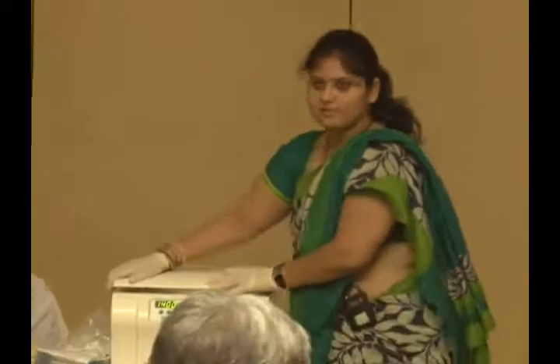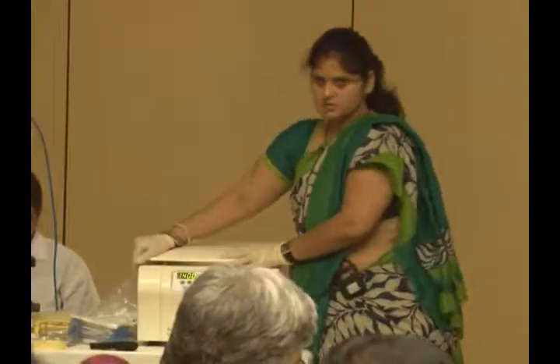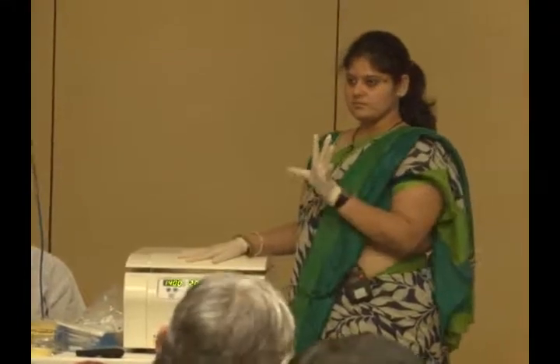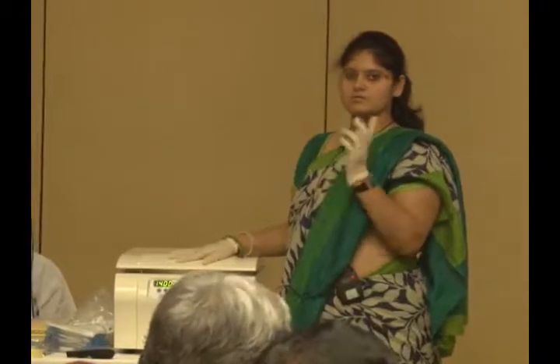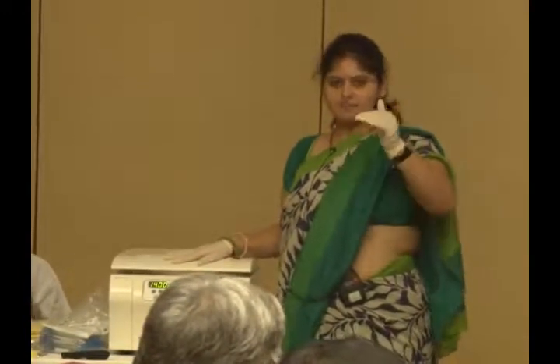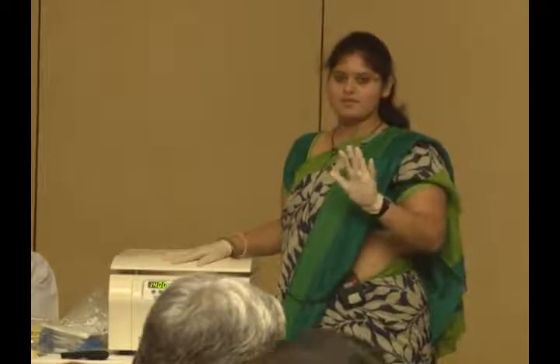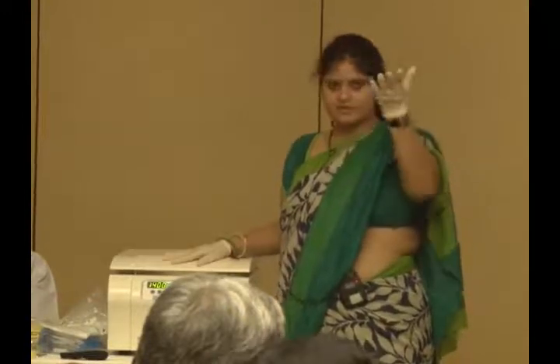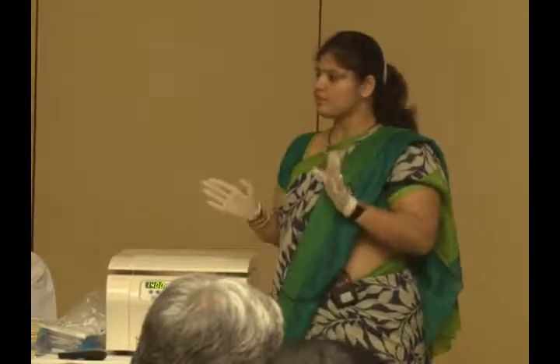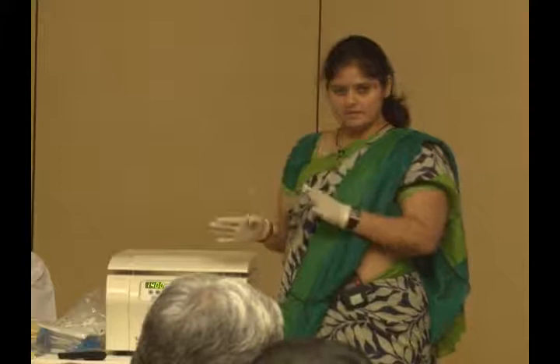The ideal time for the first centrifugation is 20 minutes, or you can put it at 1800 RPM for 15 minutes. If you reduce the time and increase the RPM up to 1800, there is no damage. But you cannot go beyond 1800 and you cannot go beyond 20 minutes. So remember: 1500 RPM, 20 minutes.